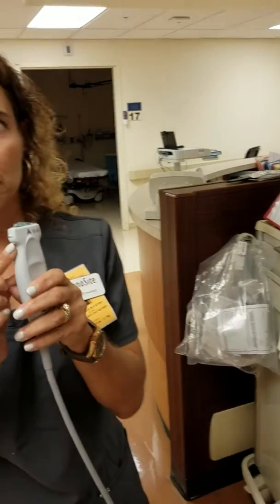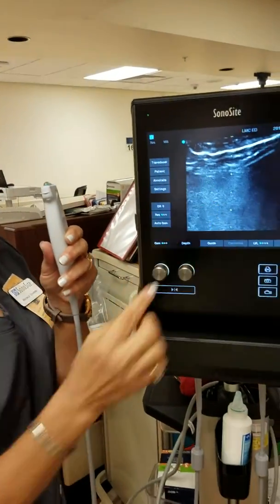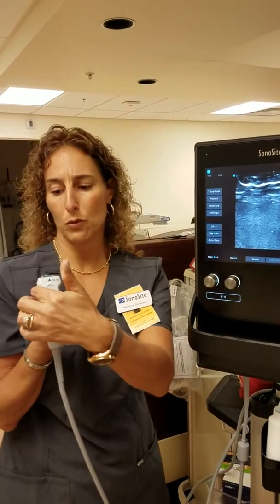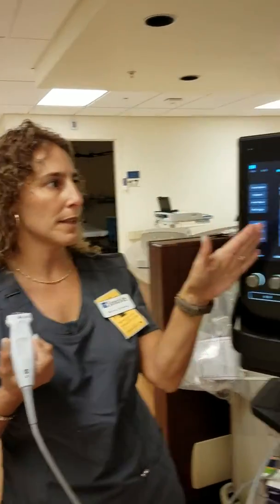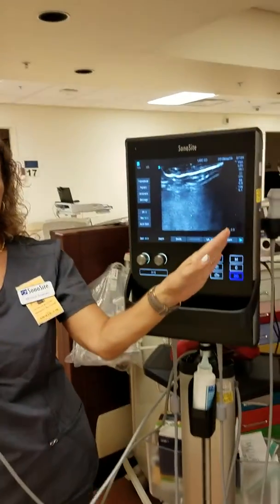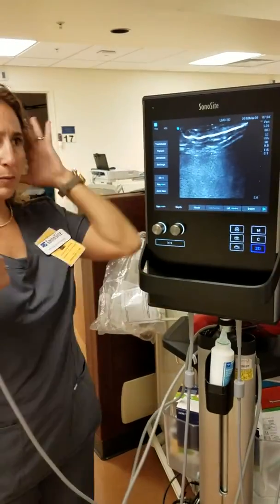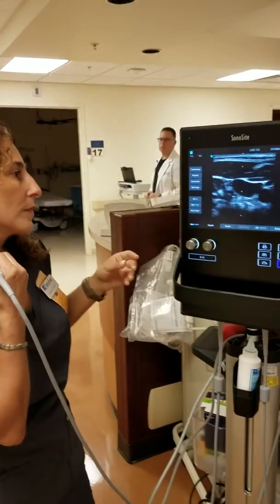This notch groove correlates to this dot right here, so you know your orientation. If I place it on my neck right here, that will tell you where it is. If this notch is on this side, that makes this lateral and this medial.